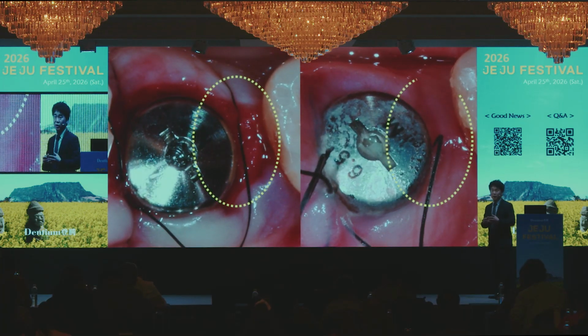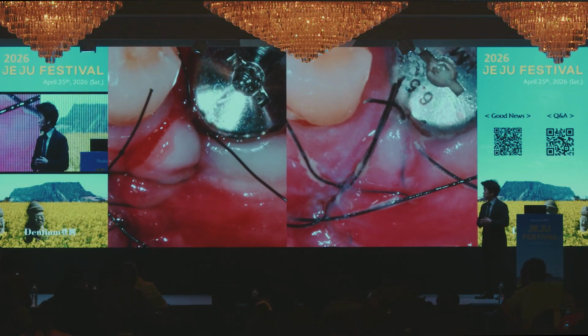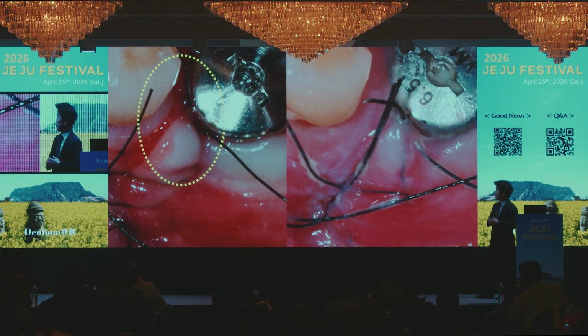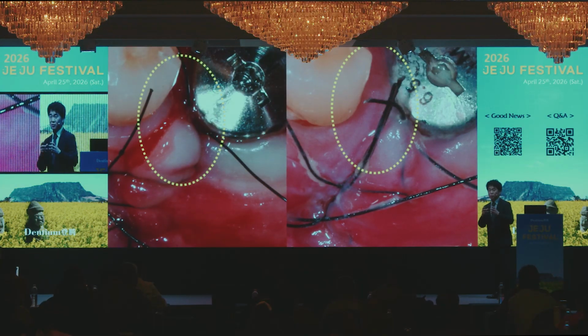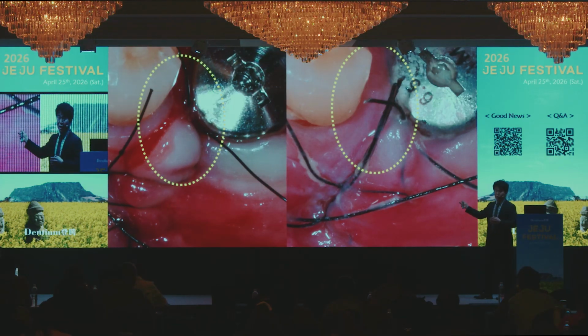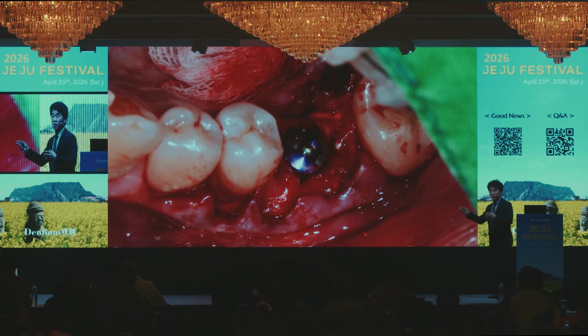I usually use the X1D in this manner. So when I want to do reconstruction for peri-implantitis, I use the collagen graft X1D.